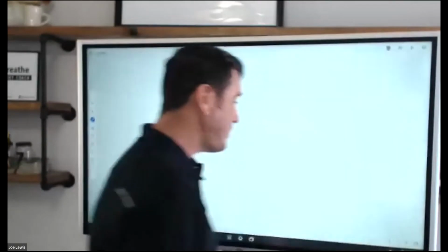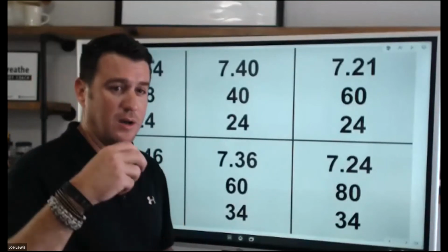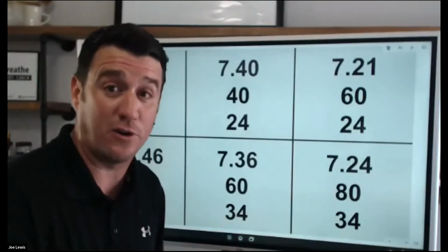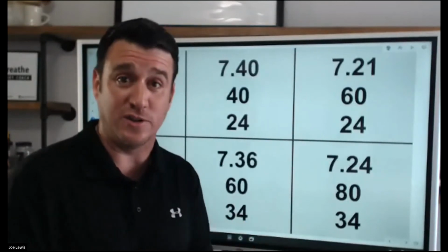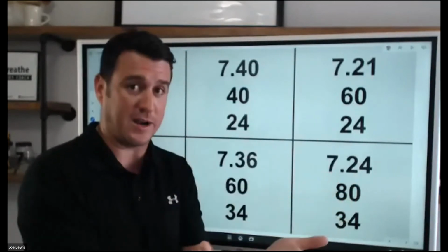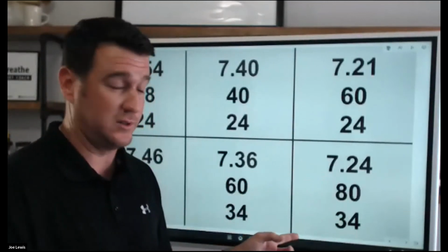Let's look at what we're looking at here. Because like I said, a lot of times when we start talking about the superimposed part, acute ventilatory failure, acute alveolar hyperventilation superimposed, like why do we have to make it so complicated? Well, it's because it is what it is. You've got two problems happening. You've got an acute problem and a chronic problem. But let's help make this make sense, okay? So we're going to tie these new terms into the older terms, okay?